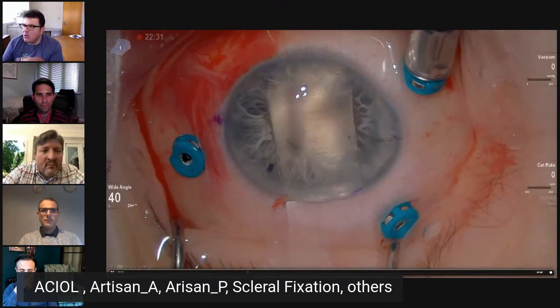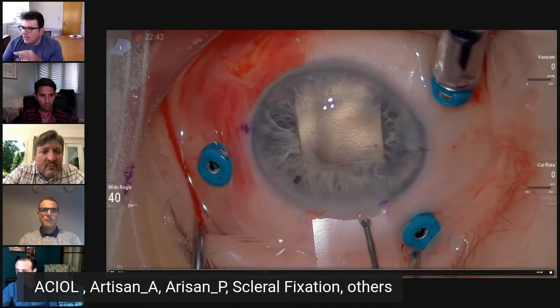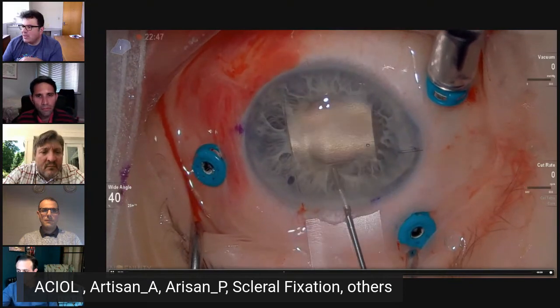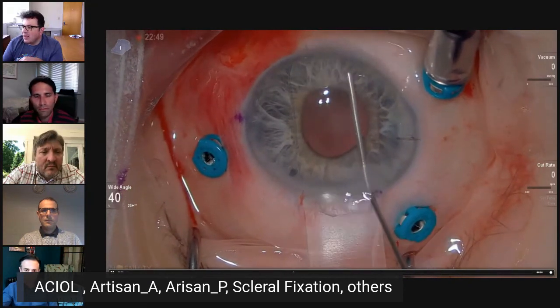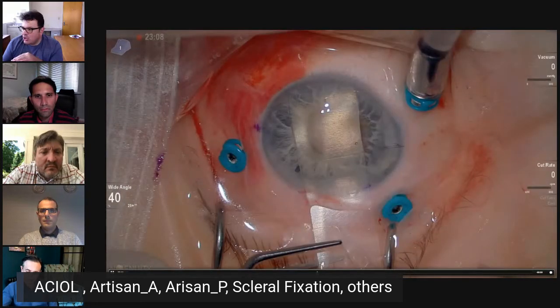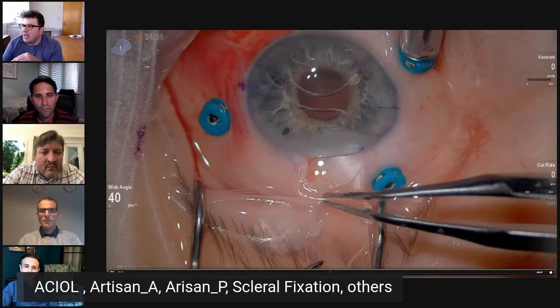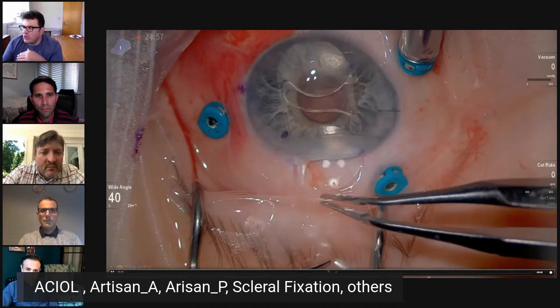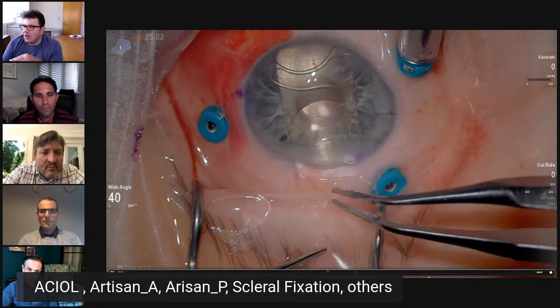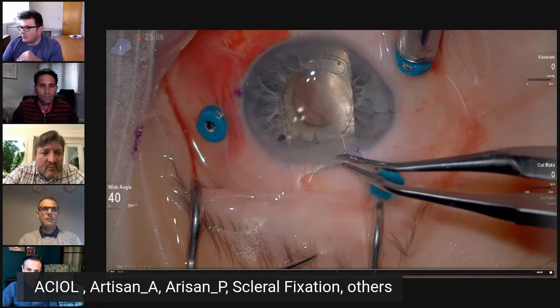So you want to really go into the angle. And if you push on the glide here, it will lift up and go into the angle. And then some viscoelastic on top of the glide. And then the lens now goes in, and as it goes in, you're pushing slightly down on the glide as the lens is going in. And now just make sure that you clear the iris, and as you push in, you pull the glide out.